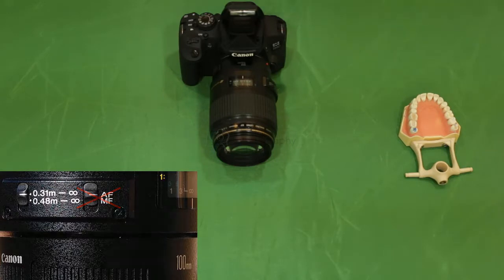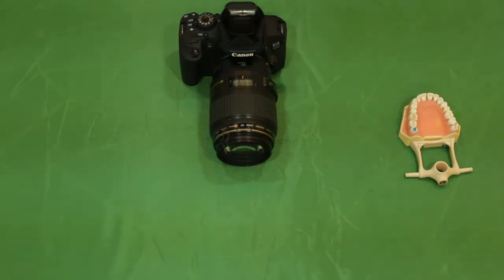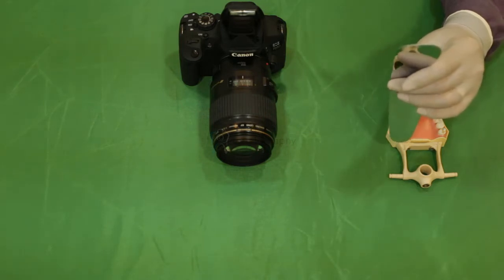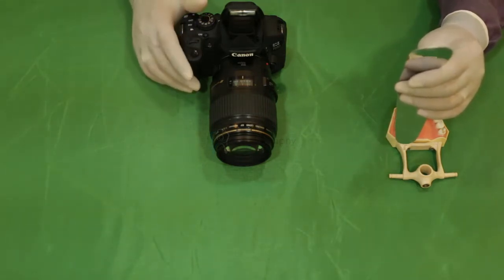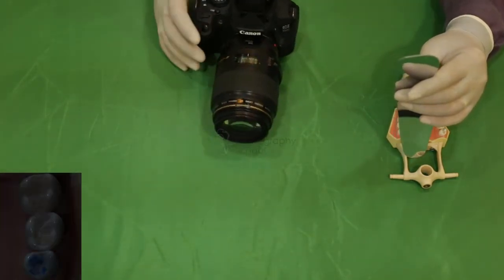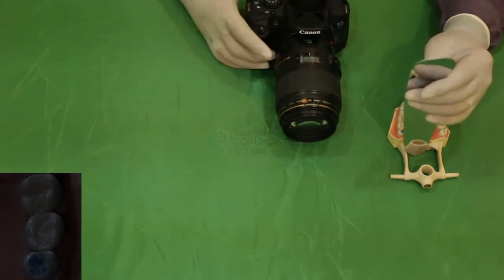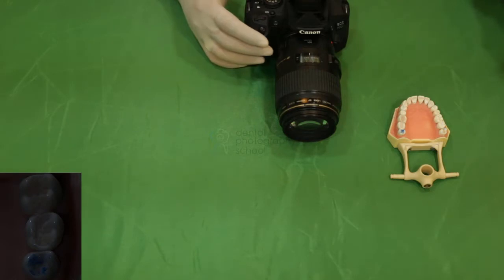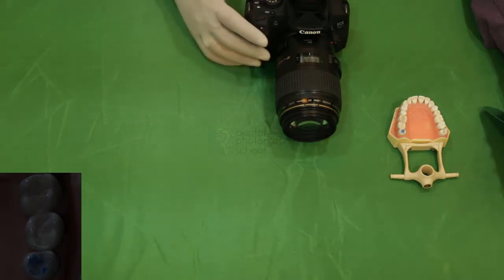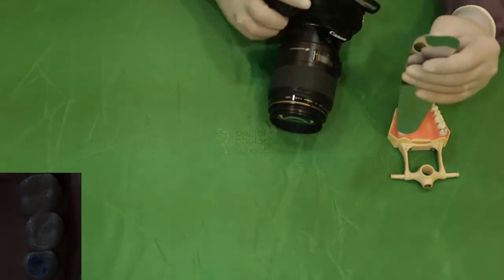Once the magnification ratio is set, we begin by removing the autoclaved sectional mirror and proceed towards recording the first image of our surgical field. Please understand that the settings on our DSLR at this point are completely arbitrary. This is the first image recorded using these settings. We shall be making changes with respect to exposure based on our exposure triangle knowledge and understanding, and we shall record one more image.